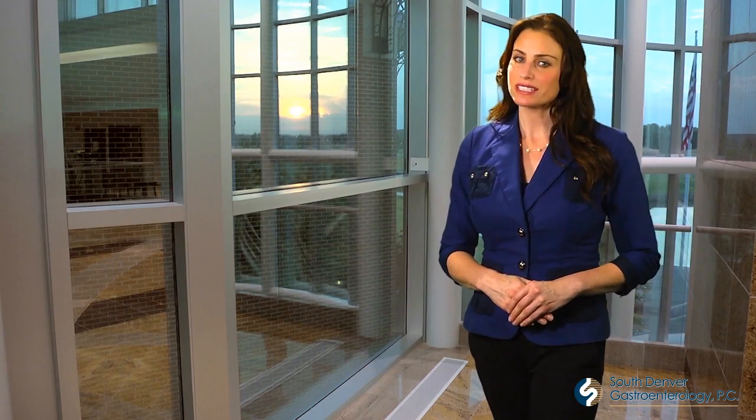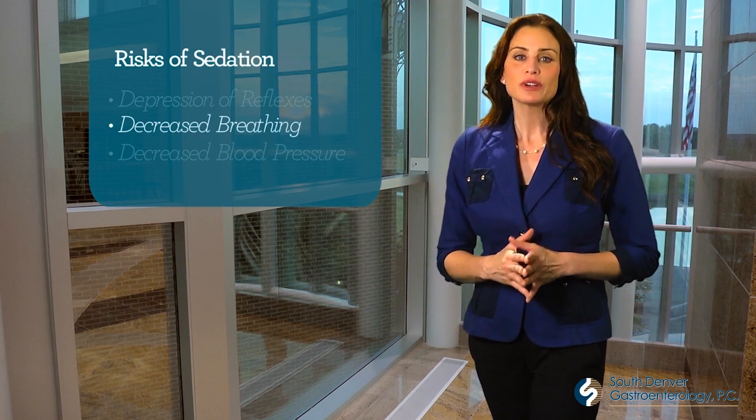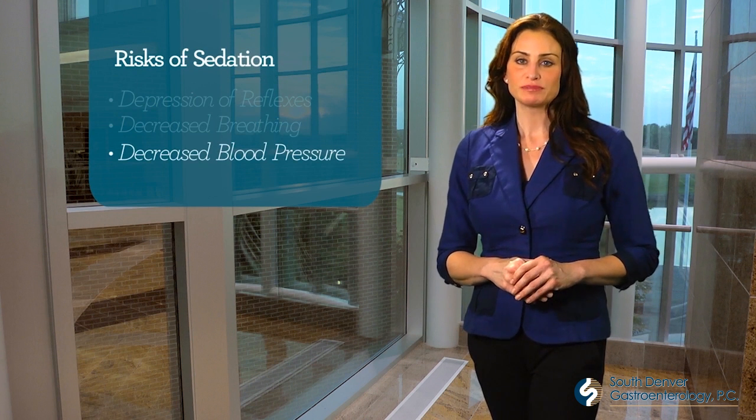EGD rarely causes discomfort. Prior to and during the exam, your doctor may give you intravenous medications to reduce anxiety and to provide sedation. These medications might make it difficult for you to remember the exam. Some of the risks of sedation include depression of reflexes, decreased breathing, and decreased blood pressure. Side effects and complications are rare but can occur during or after the procedure. To ease the scope's insertion, a mouthguard will be placed between your teeth.